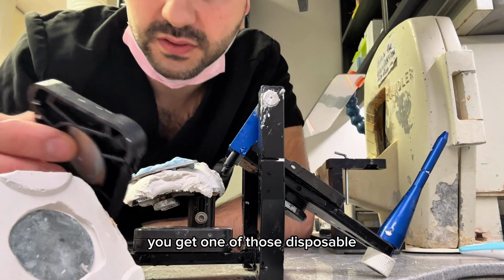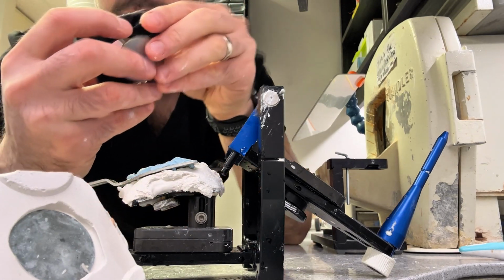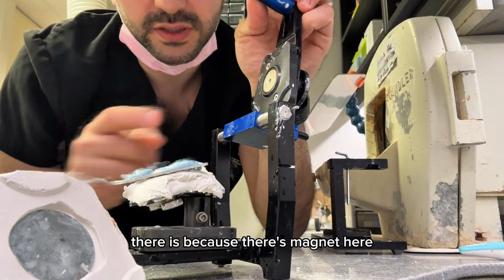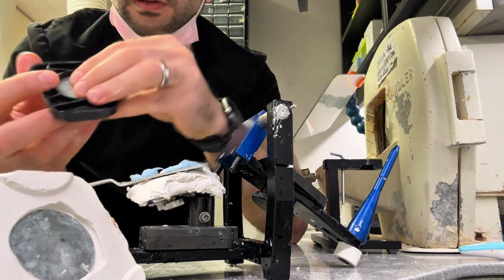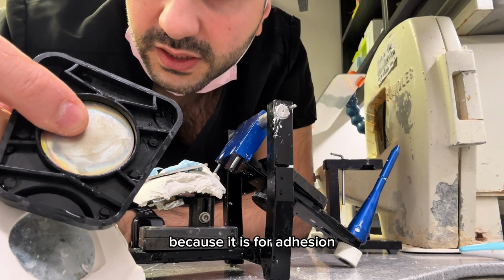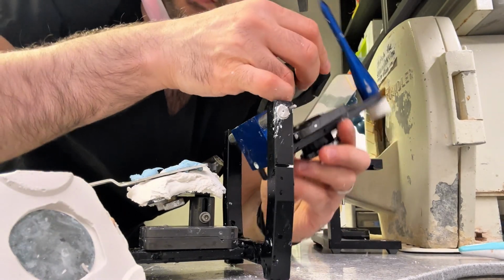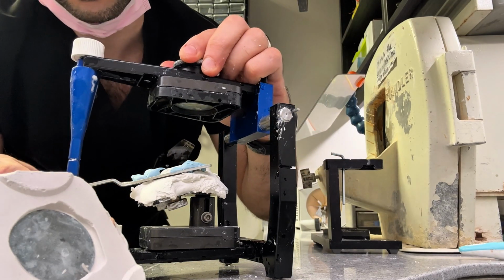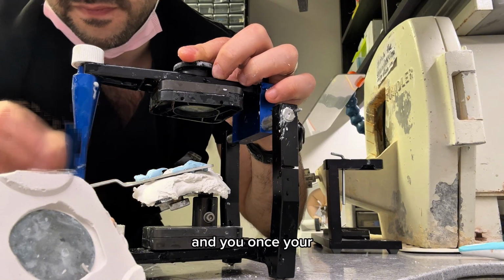you get one of those disposable platform bases. Now there's a separate magnet. The reason there's metal there is because there's a magnet here. And this surface is penetrated because it is for adhesion, for higher surface tension. See? Magnetize it, locked, good. And then you see if it's aligned.